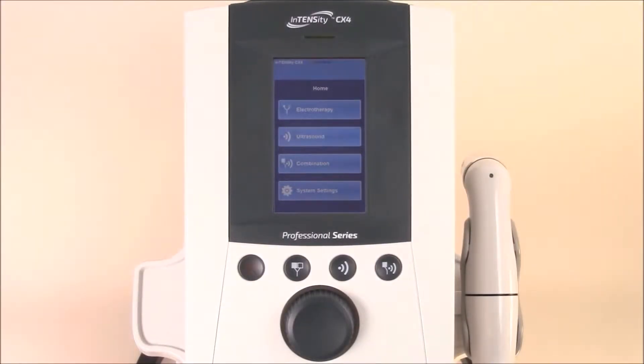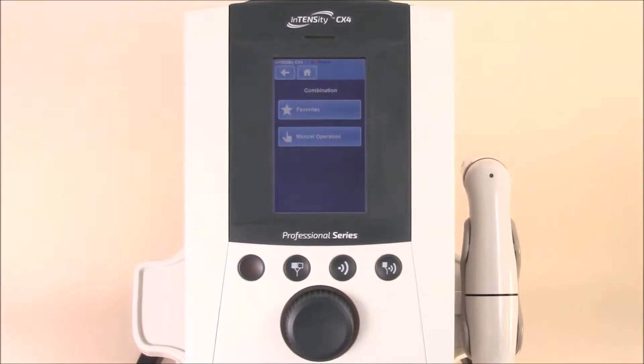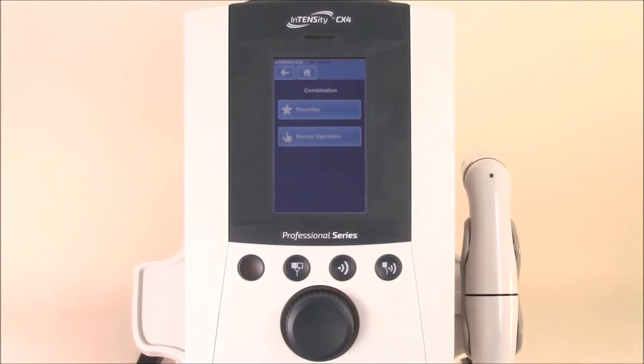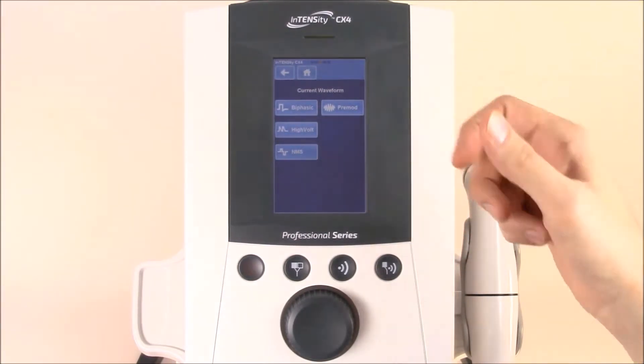Now that you're familiar with electrotherapy and ultrasound, let's jump into the combination screen. Once on the combination screen, you'll notice that you only have manual operation and favorite options. Simply open up the manual operation, and you'll see that your first option is to select a current waveform in the electrotherapy portion.